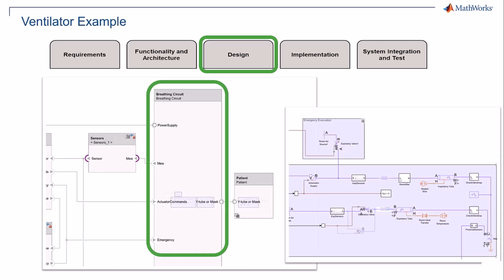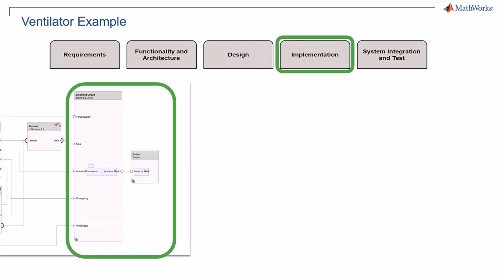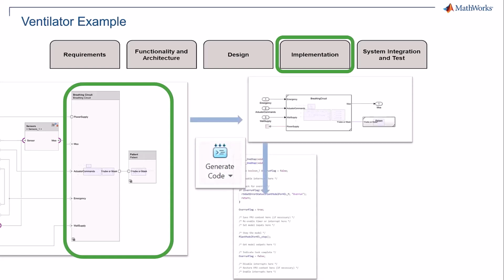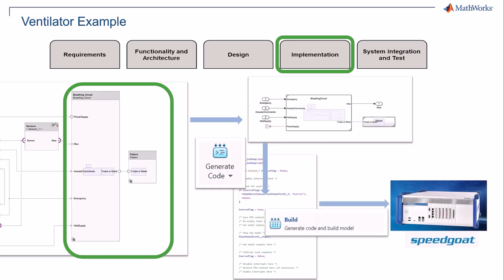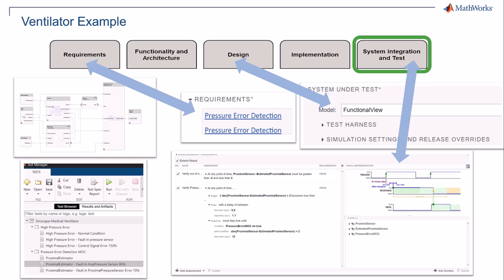The plant model consists of a breathing circuit and a patient model. Both of these are implemented in the Simscape Moist Air domain. Thanks to code generation and a great collaboration between MathWorks and Speedgoat, you can easily generate code and deploy your algorithm or plant model onto a Speedgoat for HIL or rapid prototyping. And finally, you can verify your most critical requirements, those that come from your FMEA, at an early stage, long before your prototypes are built.